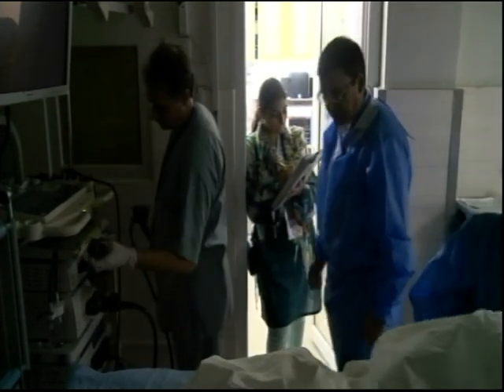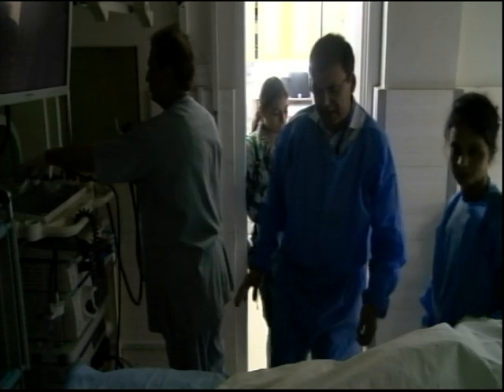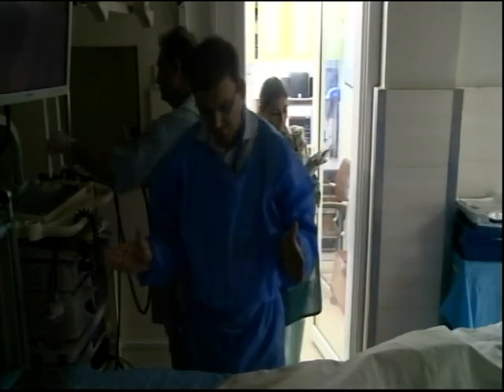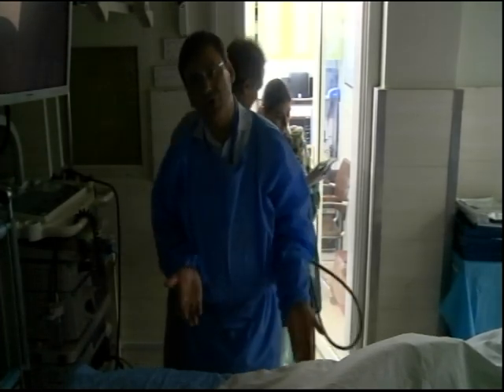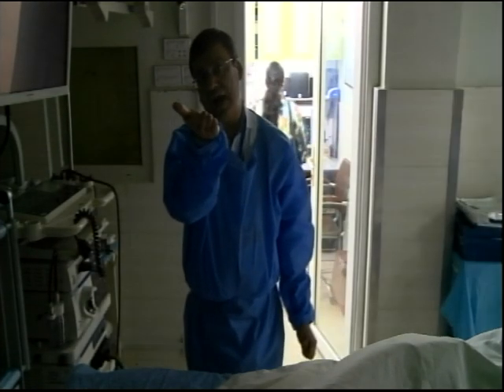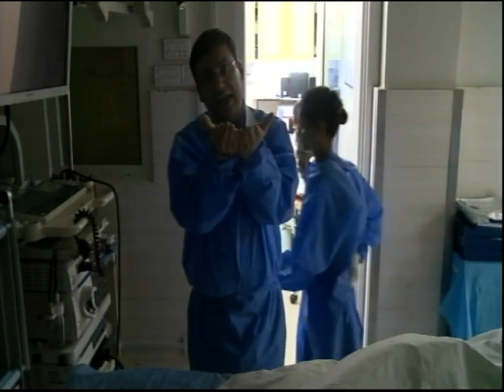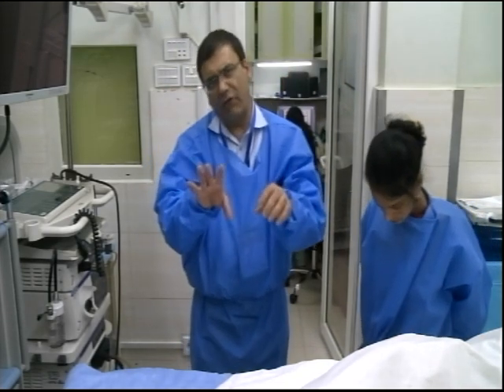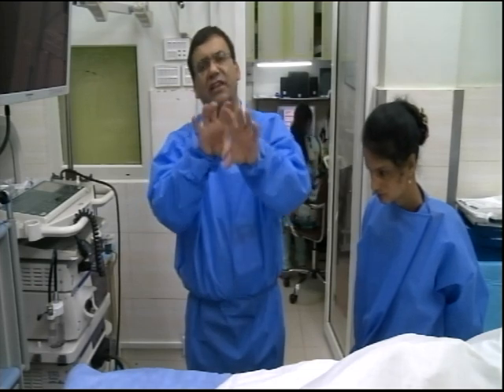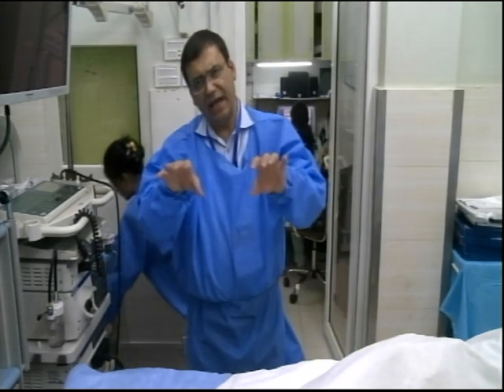Okay. Khalid, can you just tell us what would be different if it was a male patient? So in the male, especially with the radial, the first thing you do is go in, find the iliac vessels, come back, and see the bladder. You put the bladder right on the top and you start pulling your scope back in the same orientation. Next you would see a lot of irregular structures that may appear like vasculature or cystic structures, I should say. When you put flow on those, you don't see any flow. Those are the seminal vesicles. You pull it further down, you're going to see the prostate there.